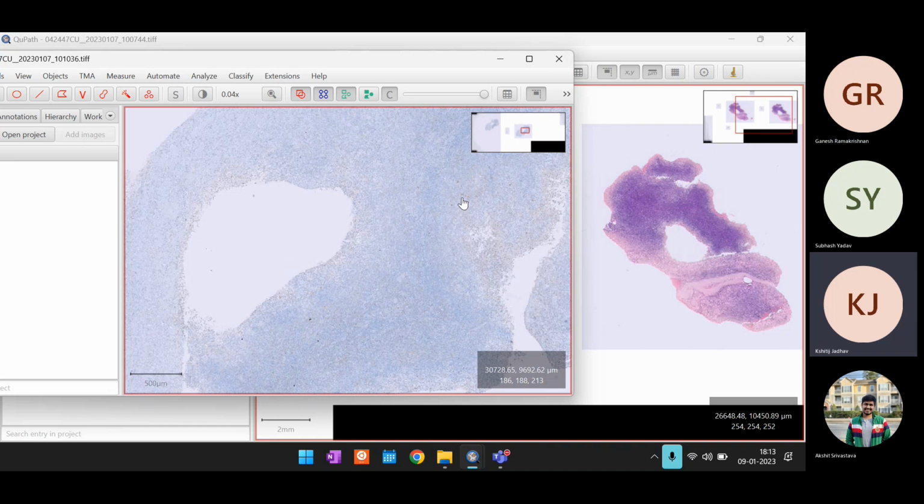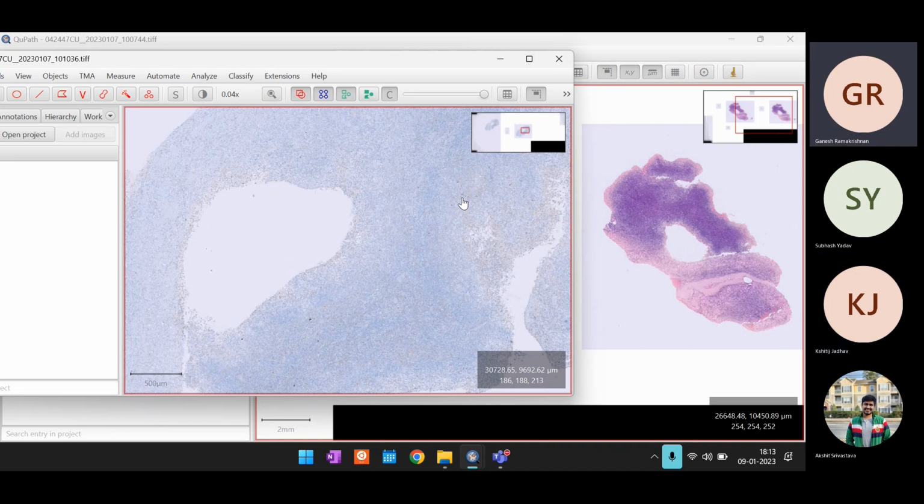We identify the location, and then we overlap this image with the H&E image, the pink image here, which will not be an exact overlap, only approximate, but that is still okay. We delete those Reed-Sternberg cells from the pink image. Once we do that, we do some unsupervised clustering to identify if there are different types of microenvironments.